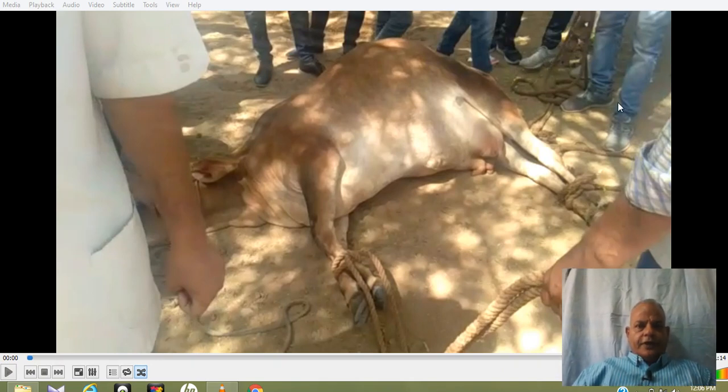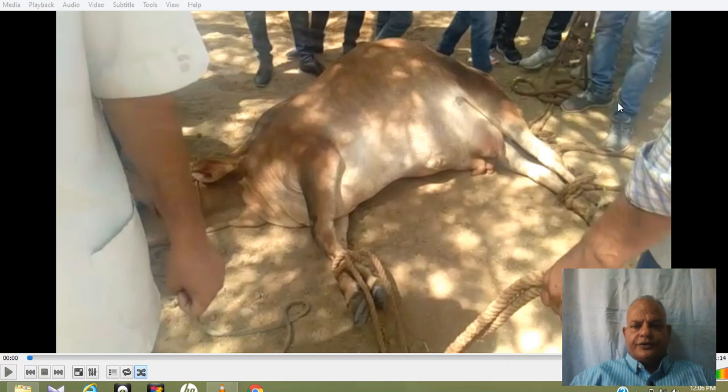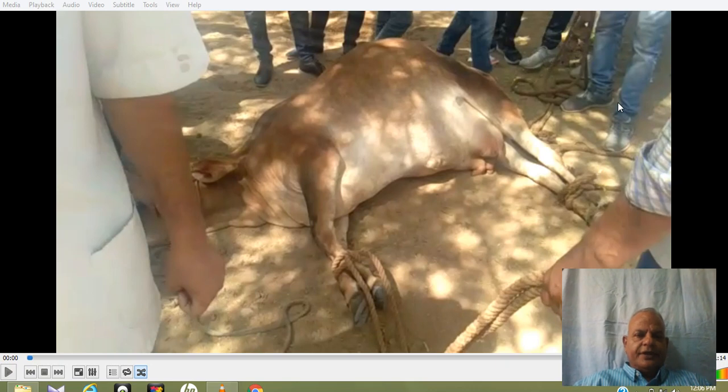This video shows how uterine torsion can be corrected. This animal was having right-sided uterine torsion. It has been placed in right lateral recumbency, and both the forelegs and the hind legs have been tied together separately.